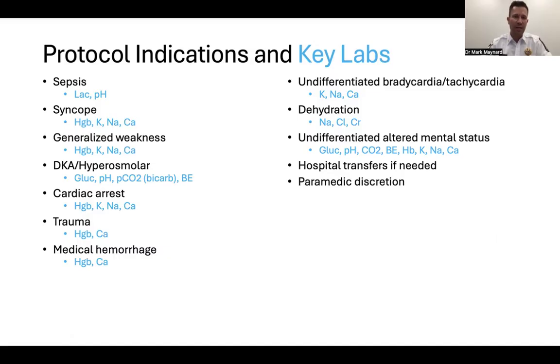Also, one of the indications is paramedic discretion. So if you feel like the patient may have lab abnormalities, we can check. And just remember that once you get the labs, now you've got to explain them. And so please use your discretion when doing that, but you know that you can perform that lab work if needed.